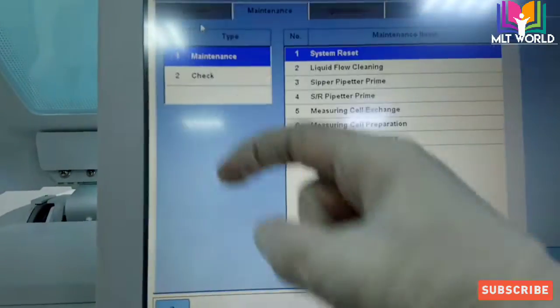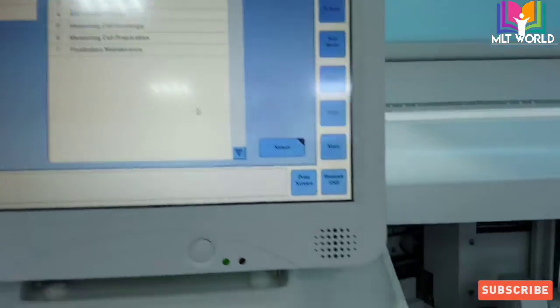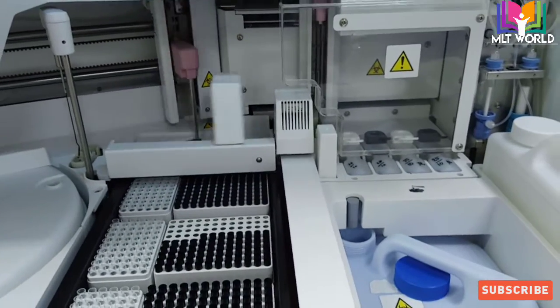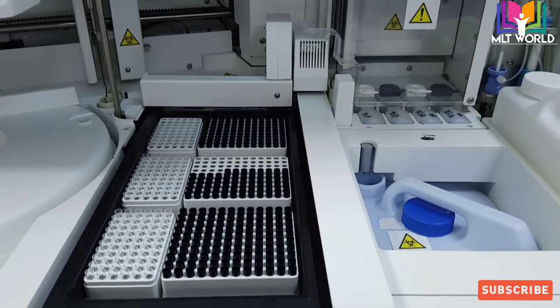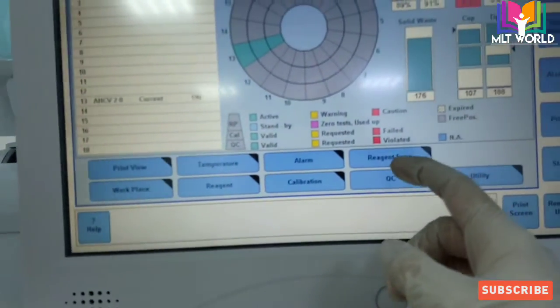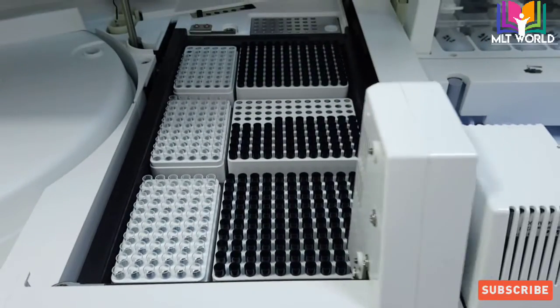You can see the maintenance button is red because the machine is asking for a system reset. If during machine operation you open any cover, an alarm will come. Just click system reset and the machine will perform a small initialization. After reset, we will do the reagent scan — during the reagent scan, it will not only scan reagents but also check the clean cell bottles, pro cell bottle, and the cup tray.